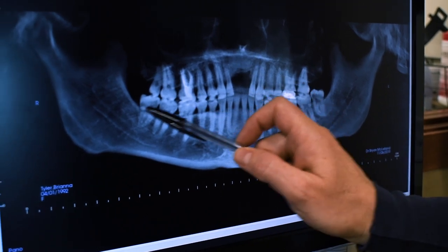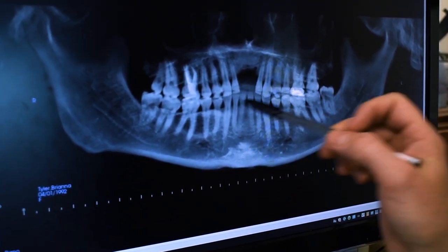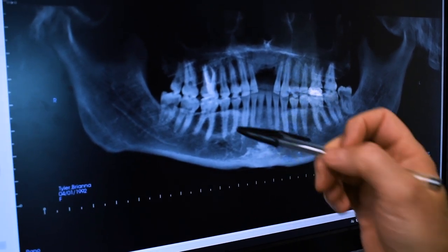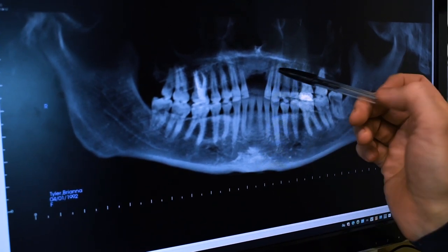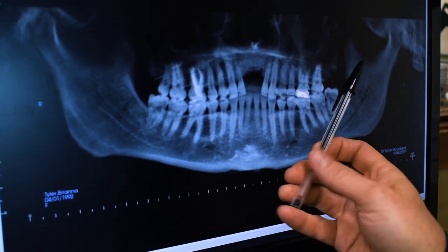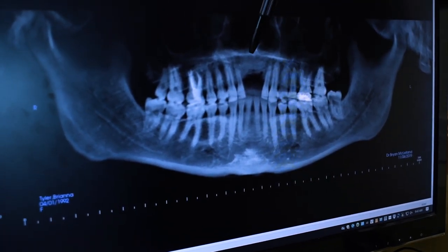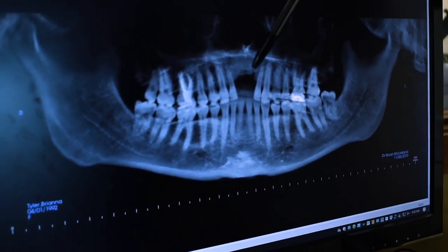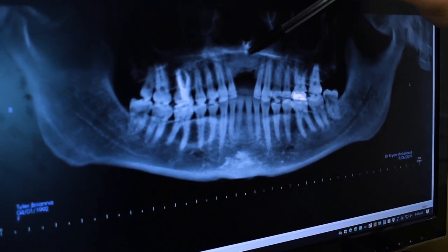First of all we have these three wisdom teeth that need to come out - that's kind of a no-brainer. One thing we will do when we take these out is use a bone suction trap and save any autogenous bone - any of the patient's own bone - so that we can use it up in this area. This is the area where the two teeth were lost when she was seven. She describes a previous grafting procedure where they used bone morphogenic protein; she said she had a lot of facial swelling.